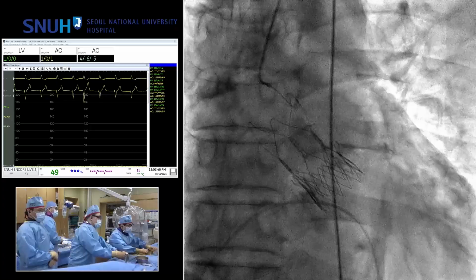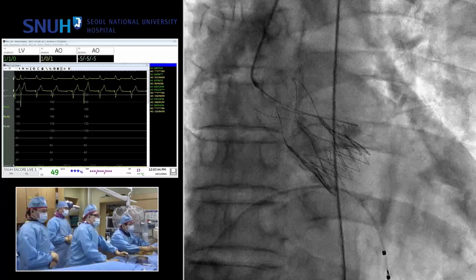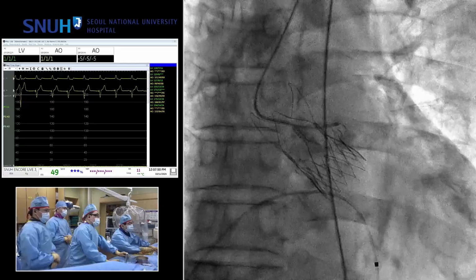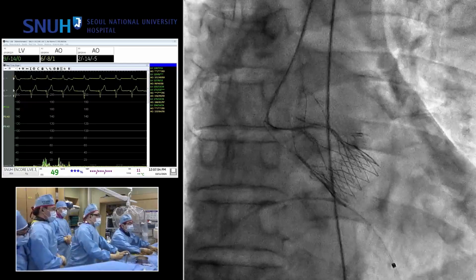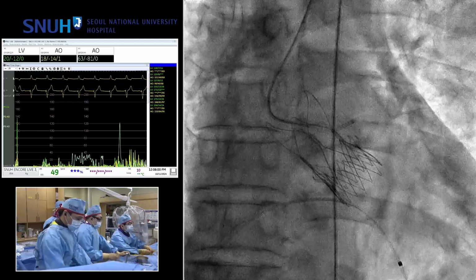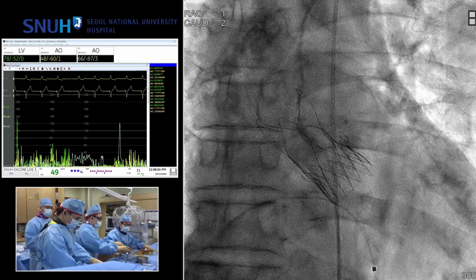I always prefer the remaining of the coronary wire. No, it is a curved wire. Don't worry about it. I always use a guiding catheter because we can check the engagement. But he gave me the diagnostic catheter, thus I could not check the engagement.